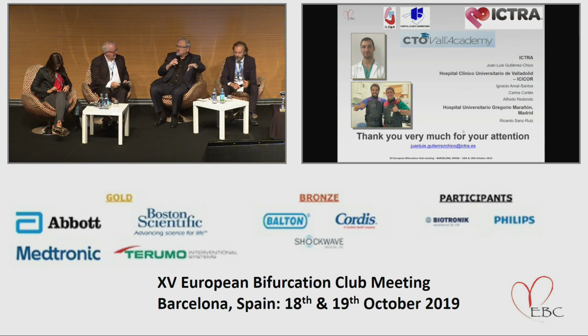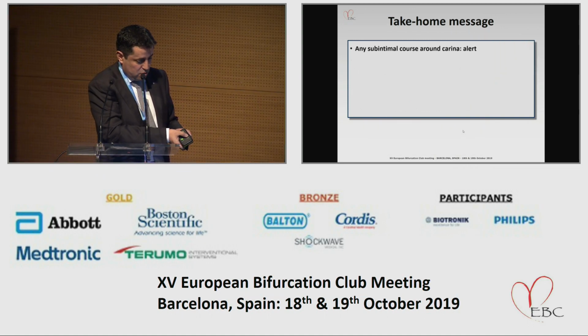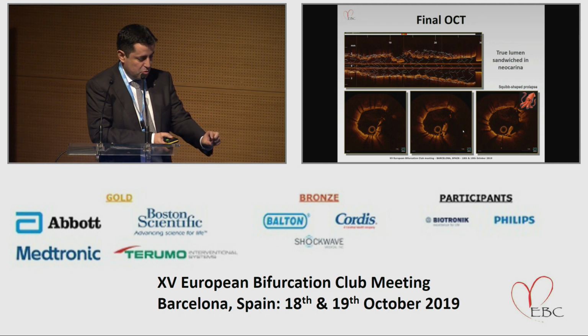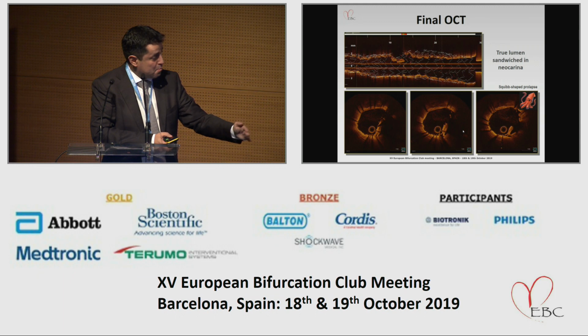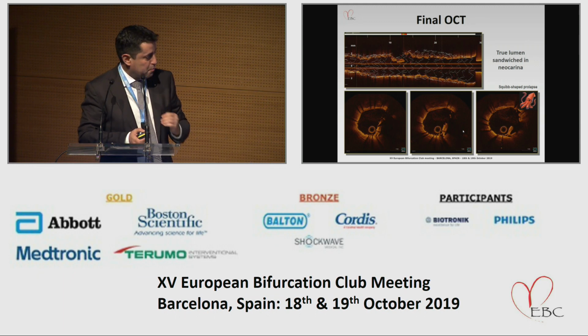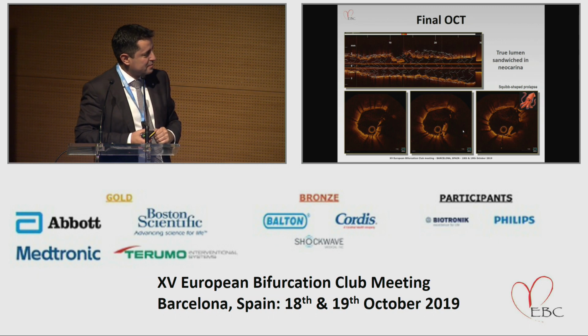So, Chico, the squib, like you call it, it's a kind of plicature of the re-entry. That's what we see there? Yeah, I think the interpretation, I'm trying to go back, is if you think of the subintima, the true lumen squeezed against the vessel wall, this is the continuation up to the neocarina. And if you see the three ones, the left one is the most distal one, and the right one is the most proximal one. It's like the intimomedial flap bending and leading to the squeezed true lumen.